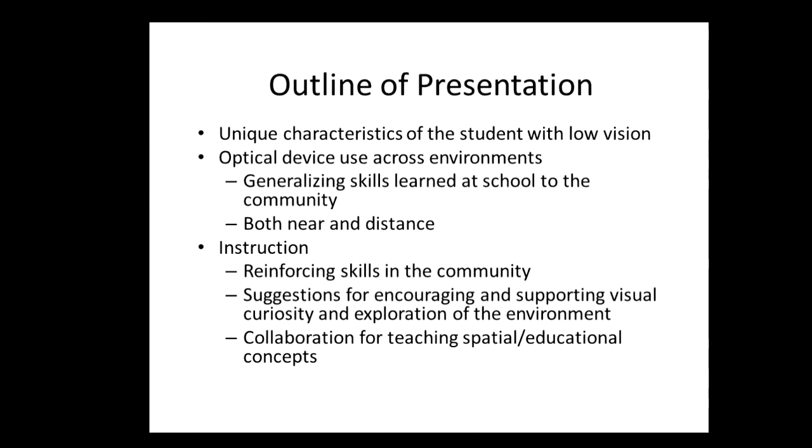This presentation will cover the unique characteristics of the student with low vision, generalizing the optical device skills learned at school to the community for both near and distance tasks, and the specialized instruction necessary to reinforce skills and teach new skills specific to some home and community settings. Remember, please be sure your student has been evaluated by a clinical low vision specialist before you begin optical device training.